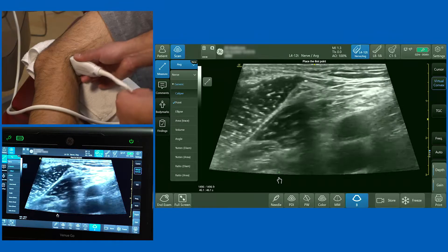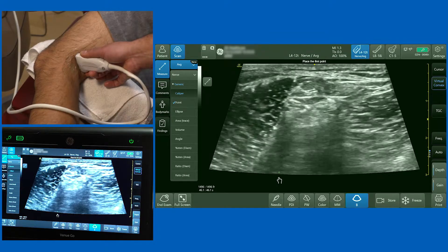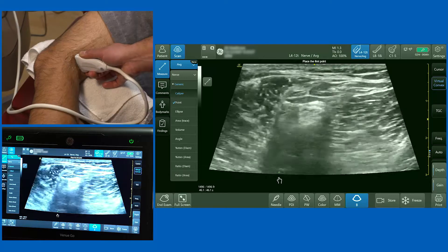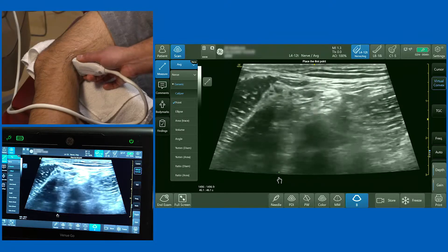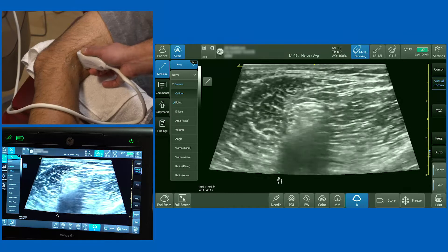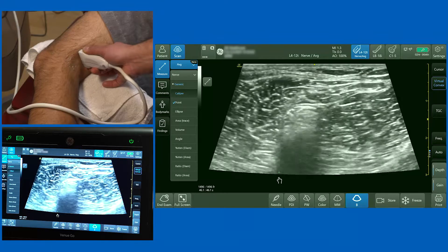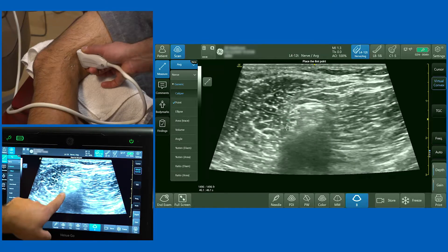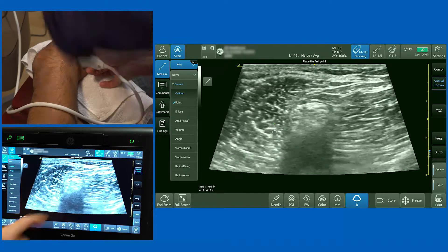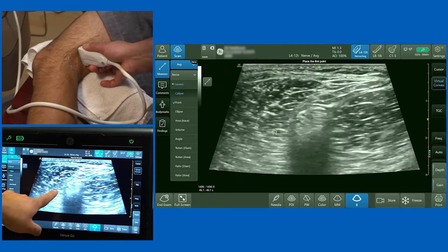Using the tilt function — moving the tail of the probe up and down — I can keep a nice view of those structures at all times. Often you'll identify a good view of the nerve by directing the beam in a plantar direction. At this point you can see the two structures, the common fibular/peroneal and the tibial nerve, coming together and joining in a common sheath called the circumneurium or paraneurium.